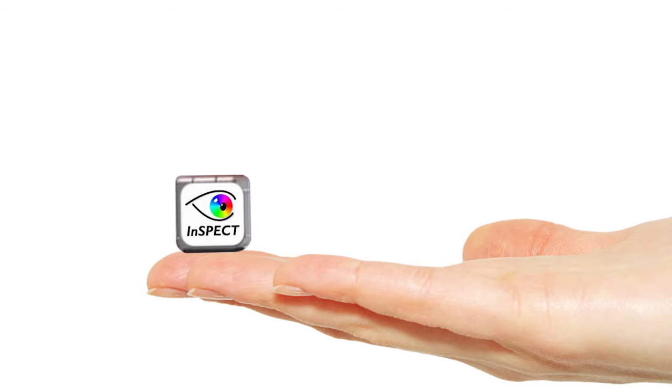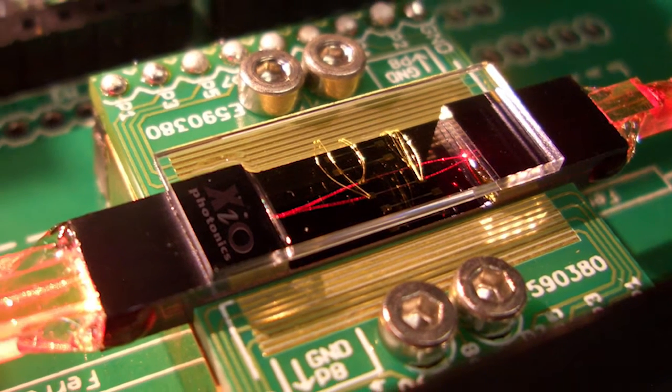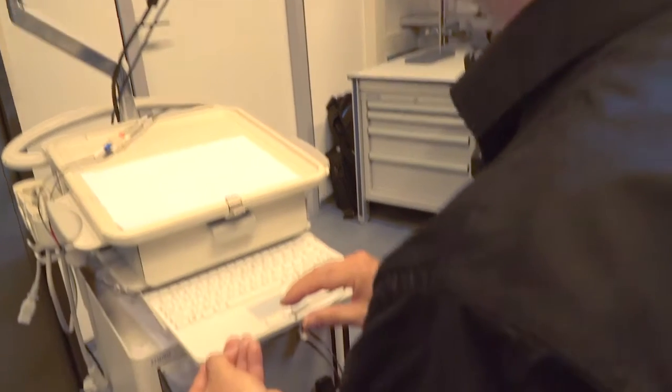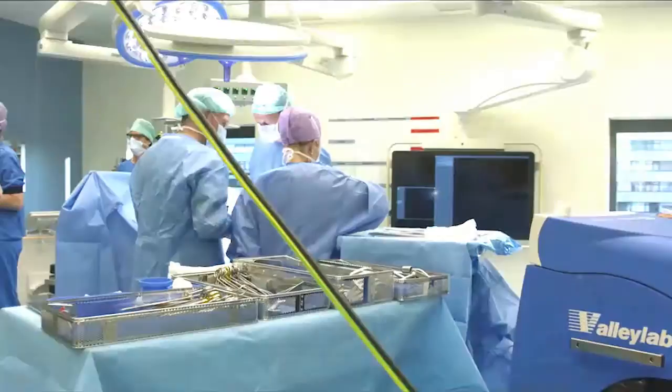The project aims at realising a LED-based compact light source, a cubic inch size compact microspectrometer and a spectrometer device on a photonic chip. Miniaturized devices such as the cube or chips can be replicated at a lower cost to make them more accessible for widespread use, such as at physicians' consultation rooms and decentralized health centers.